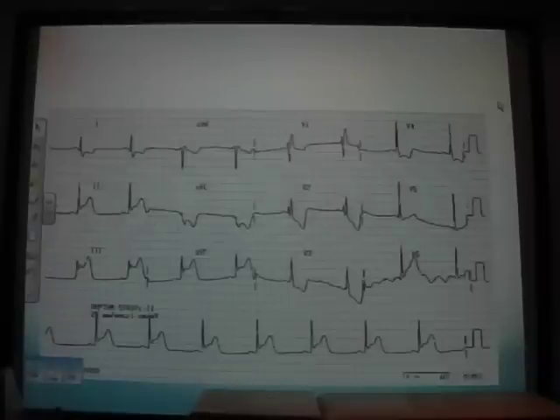The QRS complexes are distorted in some of the leads, showing ST elevation in 2, 3 and AVF and reciprocal ST depression in V2, V3, V4 and also AVL. That's consistent with an inferior MI. Yes, perfect, well done. Inferior ST elevation MI.